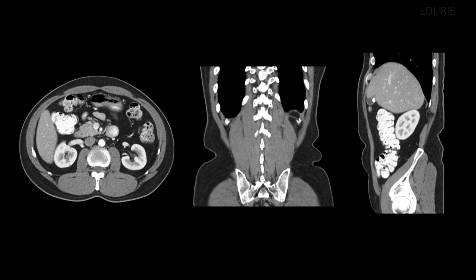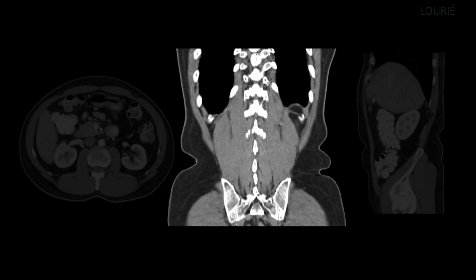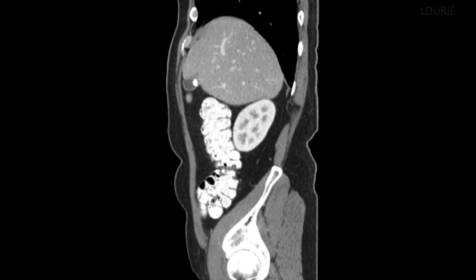Interestingly, the lateral conal fascia can often herniate through Grinfeldt's defect to form what we call a pseudosac. In the coronal view of the same patient, you can see on the patient's right side the blue tip of the 12th rib, quadratus lumborum, and the latissimus dorsi, all delineating the superior lumbar triangle — the same on the other side. In the sagittal view, we see the iliac crest, and a little higher, the blue tip of the 12th rib, the quadratus lumborum, and the latissimus dorsi forming the roof of the superior lumbar triangle.